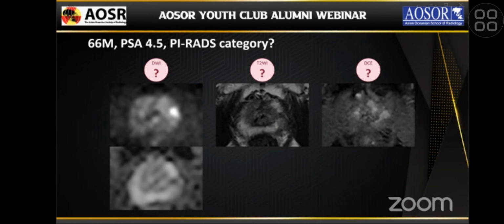So, let's evaluate some cases based on PI-RADS. Please try to score each sequence and the overall PI-RADS category.